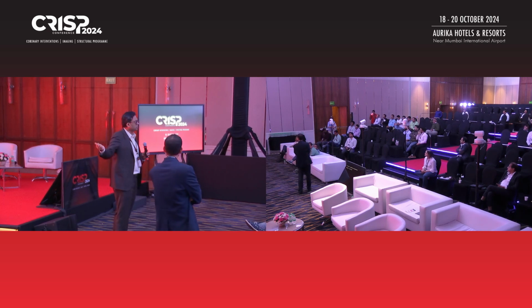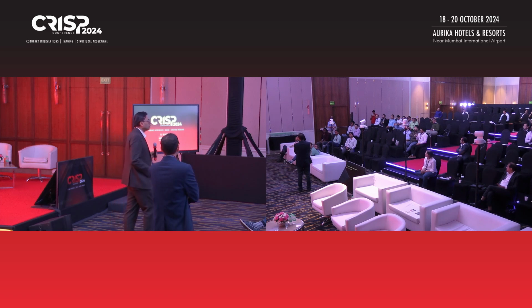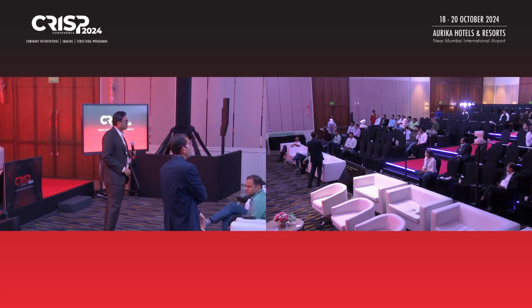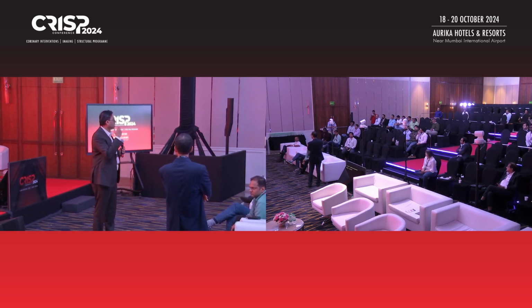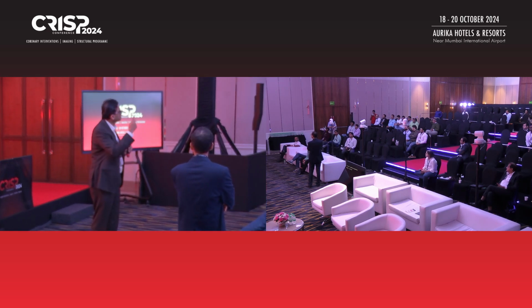Dr. Bhavesh also, I think, if you were there, showed a facilitated TAVI, recently. Both of us were there. So we did a facilitated TAVI in that case. Or if there is too much of a bend, you might have to go for a Lunderquist rather than a Safari. Absolutely, it straightens up your vessel. If you want to save money also, then when you're going in the wall, don't use a Safari, use the same Lunderquist.